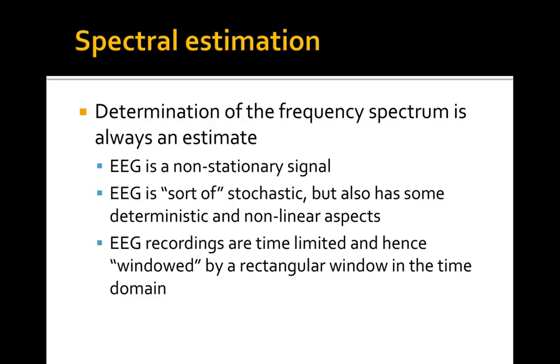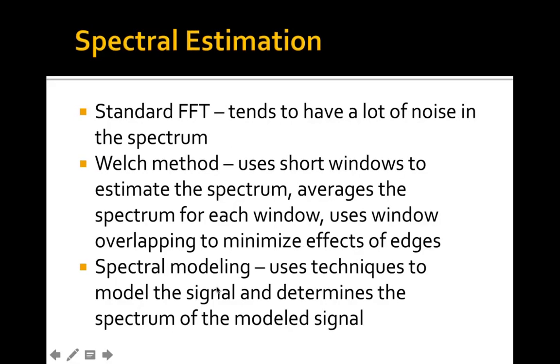It'll default to something that has more rounded edges. Yes, this changes the data shape at the beginning and the end of the data record, but it has a less dramatic effect on the resulting frequency spectrum than the rectangular window.